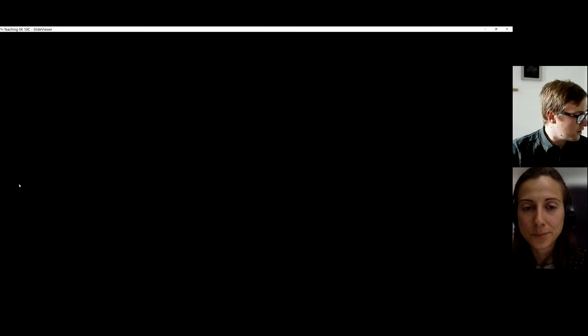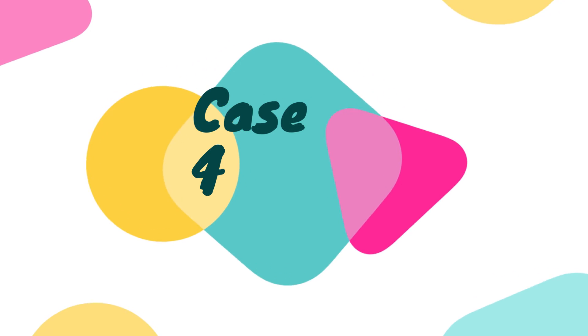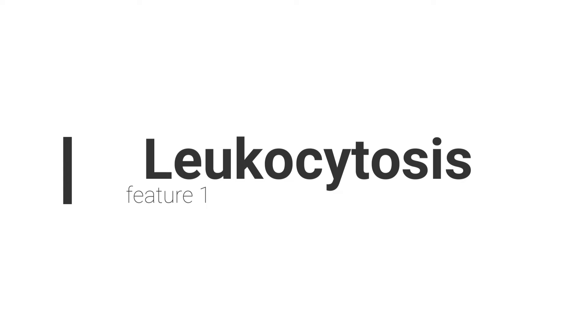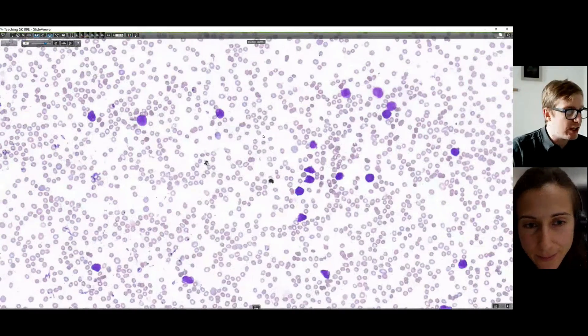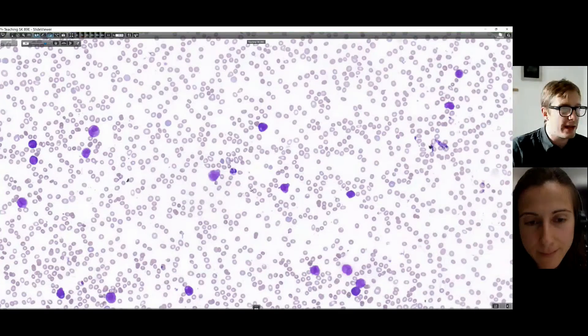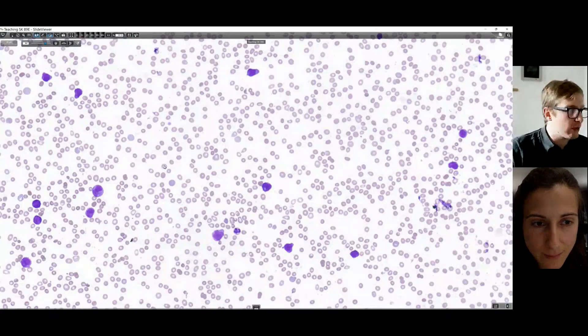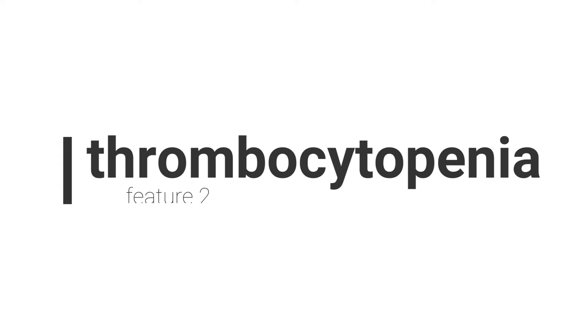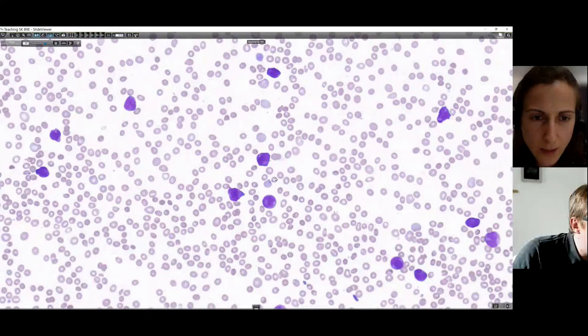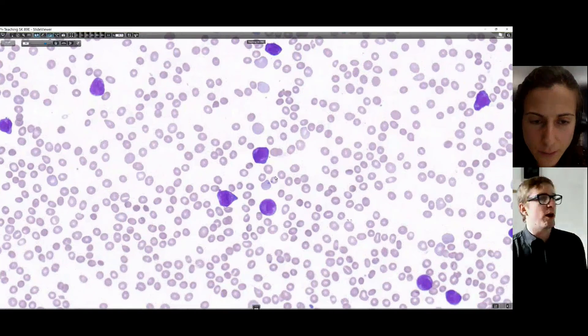Moving to the last case. Again, low power - having a look at low power. Again, there is leukocytosis. There's a pattern today. And again, probably anaemia as well. And in this one especially, you're getting a bit more marked thrombocytopenia - there aren't a lot of platelets around. This hasn't scanned quite as well but I've got to find where the cells are in focus. So describe some of these cells that you're seeing here.